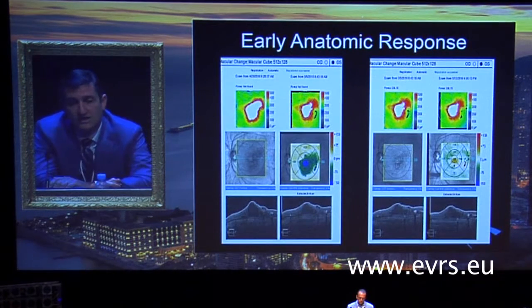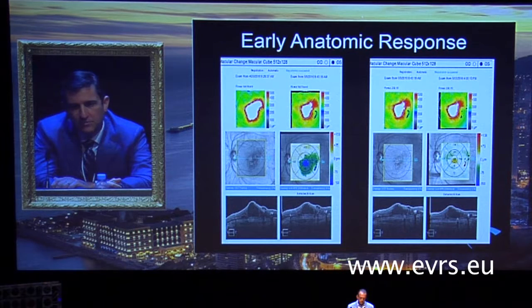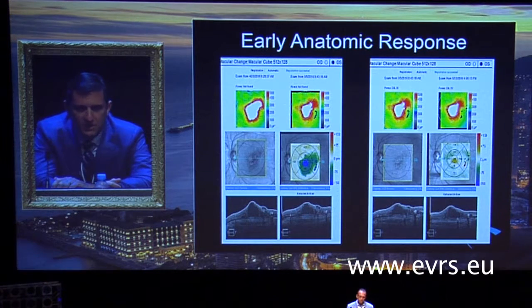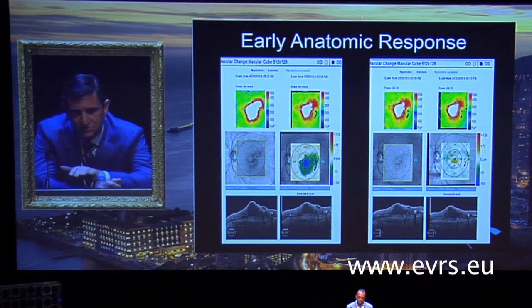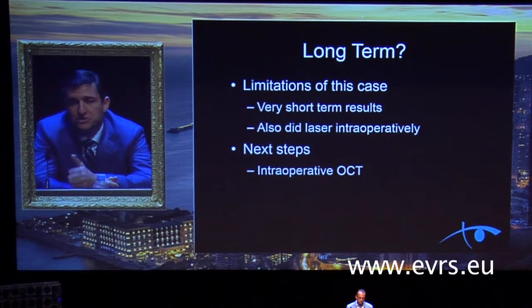So early on, the anatomic response was quite good. After just a couple of days after surgery, there was a noticeable decrease in the macular edema, and we weren't sure how long it would last. We didn't know if there would be a rebound. If it would rebound, it would be even worse. The latest image I have is all the way to the right, and that shows a continued stabilization of the decreased edema. We don't know if it's going to last. We do have a more recent image that was just taken a couple of days ago that seems to show a little bit less edema. It didn't break the cycle entirely. But really, this is just very short results.